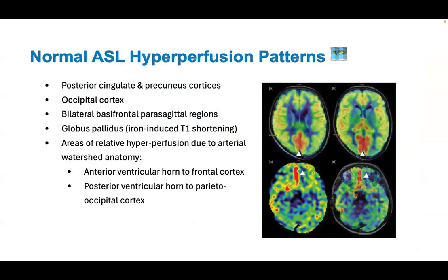But what is the real difference between ictal SPECT and ASL is that in SPECT, if you inject very fast during a seizure, your radiolabeled tracer will go and bind with that epileptogenic zone. You can image later. Still, that localization will be preserved. Whereas ASL is a dynamic thing. In ASL, there is no binding.